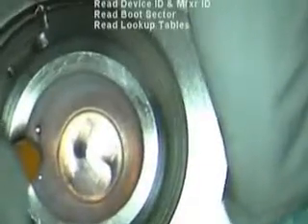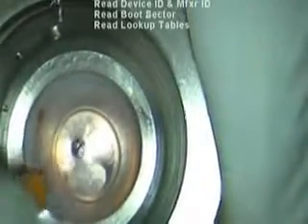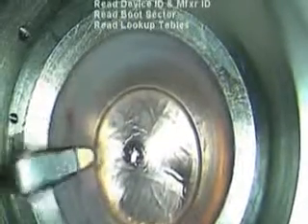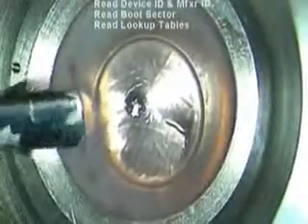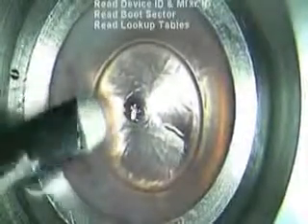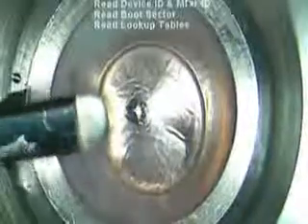A 350 micron guarded blade was used for the initial incision and a stromal pocket was made with a crescent blade. The depth of the pocket was extended over the entire cornea all the way to the limbus 360 degrees using straight and curved dissectors.